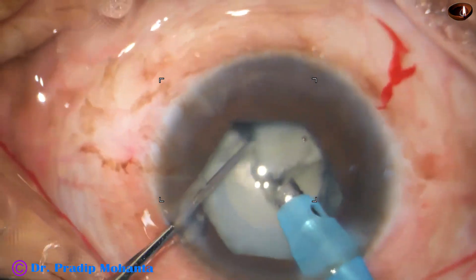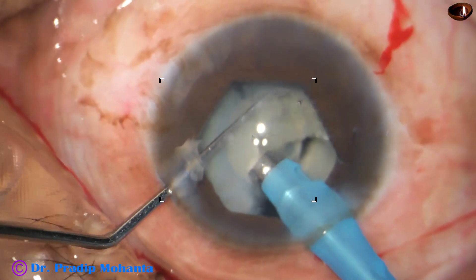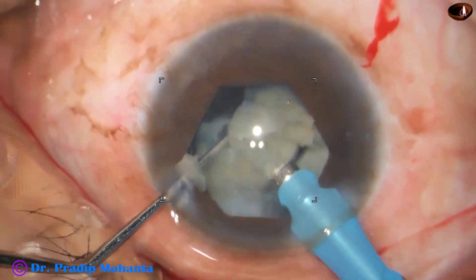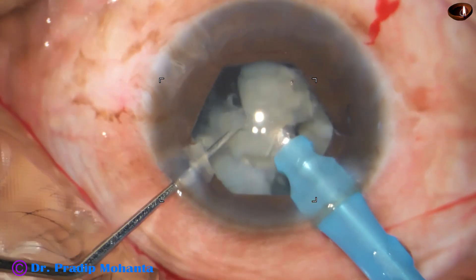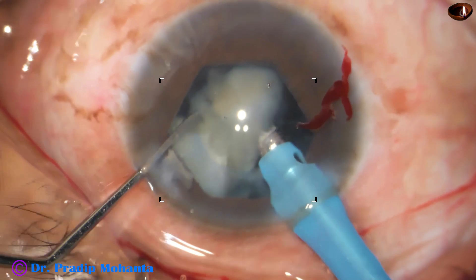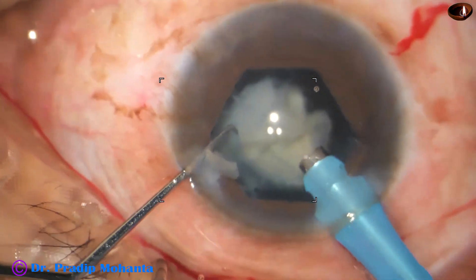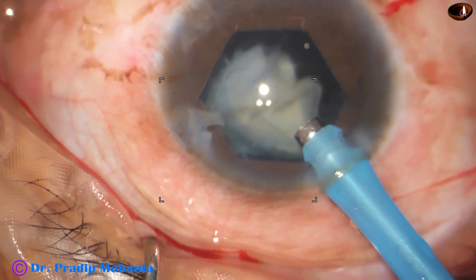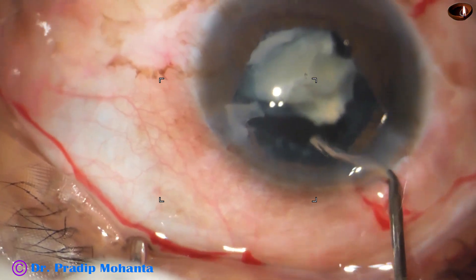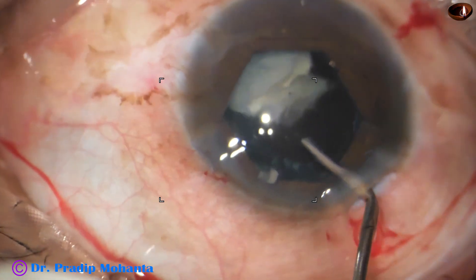As I have mentioned, the zonule is very weak and for that I have placed a CTR. The posterior capsule does not have any vertical support — the posterior capsule is moving up and down; it is trampolining. Whenever this happens, the best thing to do is emulsify the last piece after implanting the intraocular lens. That is the IOL-well scaffold technique.